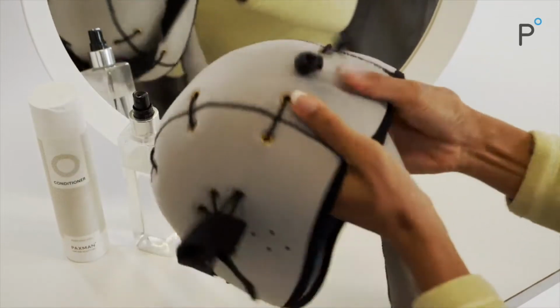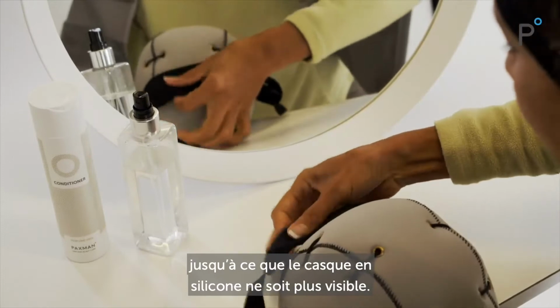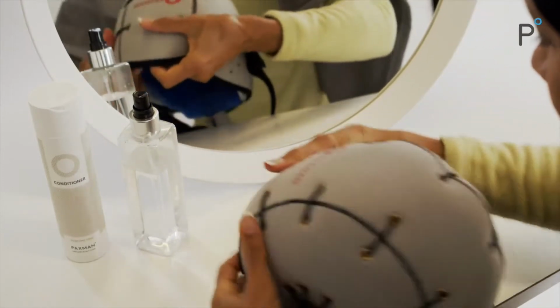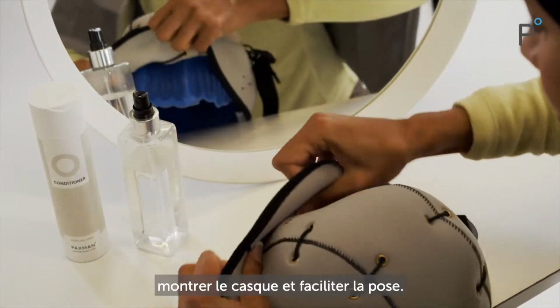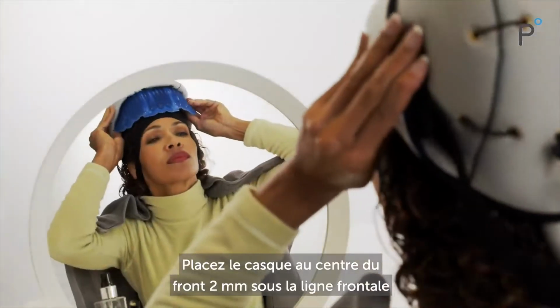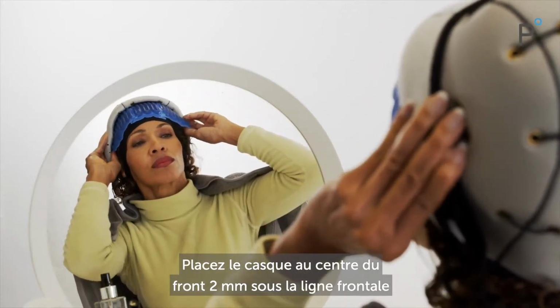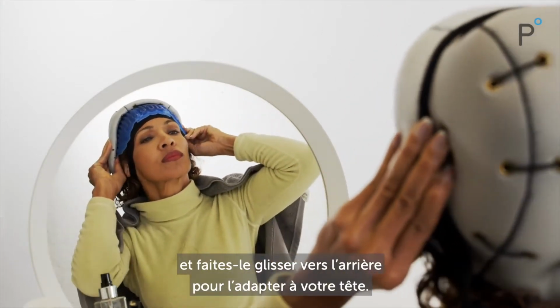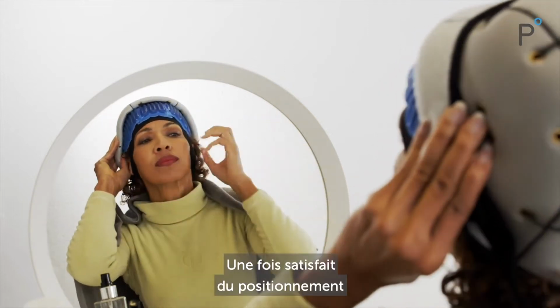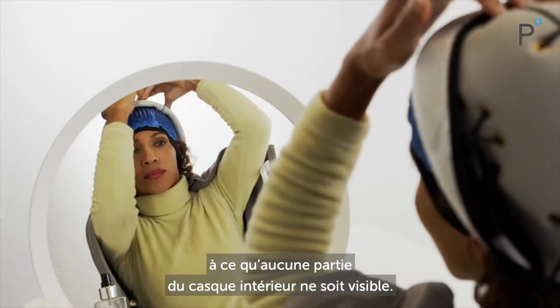Open up the cap and begin to pull the cover down until none of the silicone inner cap can be seen. Flip up the front of the cover to show the silicone cap to aid fitting. Place the cap on your forehead, centrally, 2 millimeters below the hairline, and ease backwards to fit onto your head. Once you are happy with the positioning, flip down the cap cover so that none of the inner cap is showing.